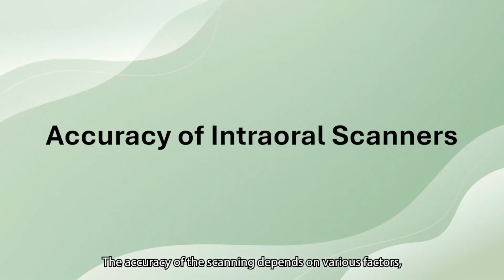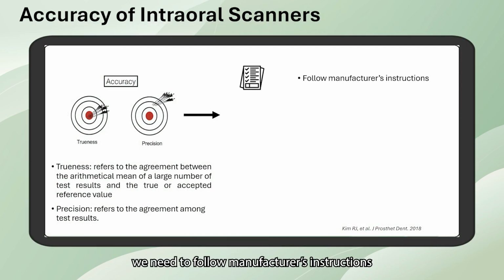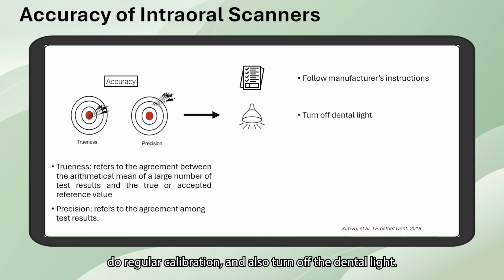The accuracy of the scanning depends on various factors. In brief, we need to follow manufacturer's instructions, such as the scanning sequence, do regular calibration, and also turn off the dental light.